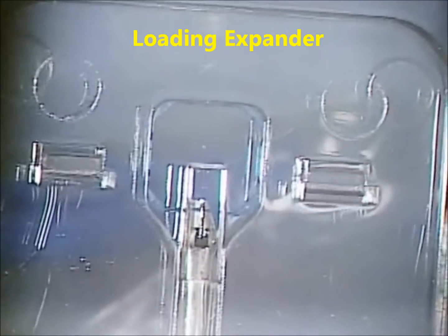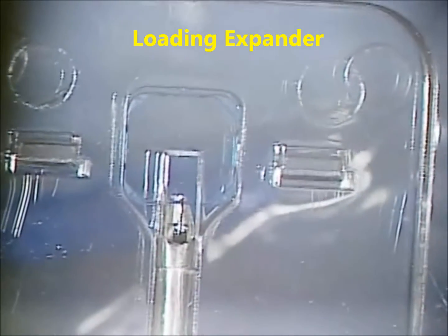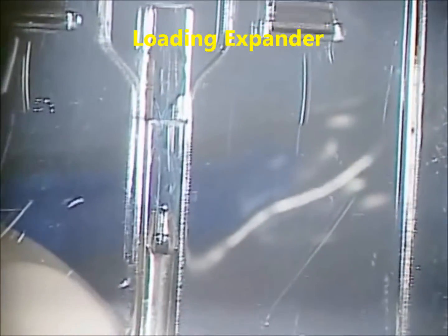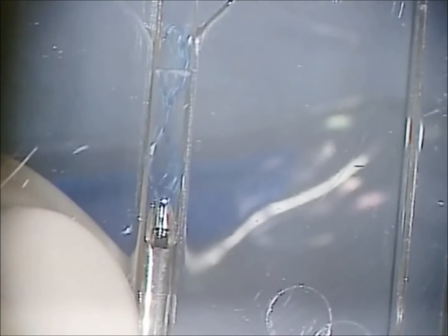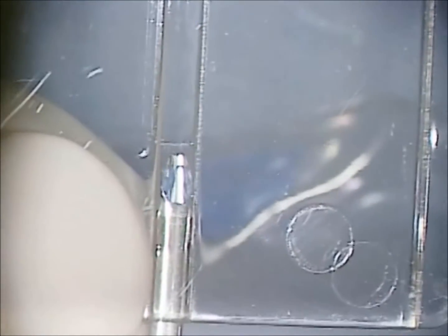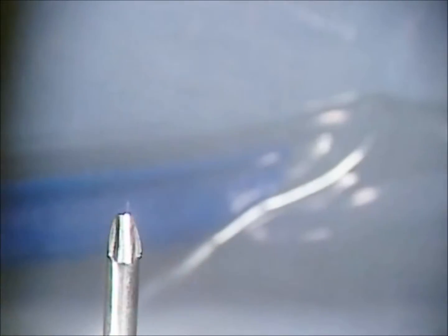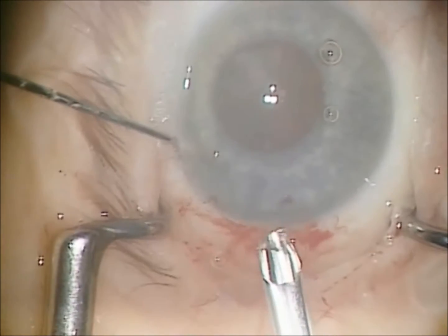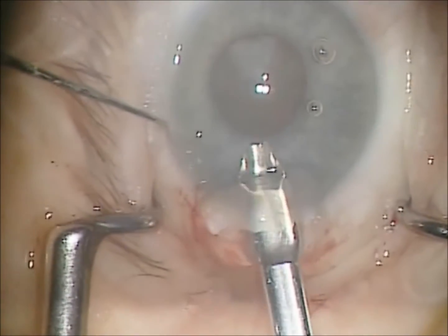To load, you actually pull back on the injector — not the retractor — to about halfway down into the channel it comes in, and then you just pull back on the button on the inserter. It goes into the inserter and then we can pretty much easily put this through probably about a 2.4 to 2.6 millimeter incision.